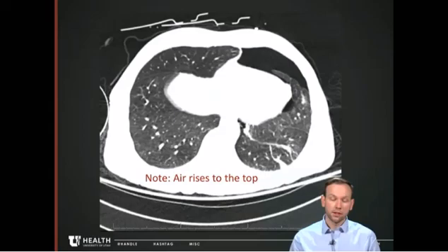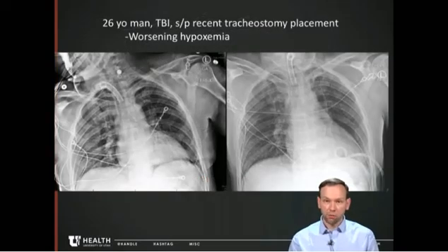side of the chest. One thing I'll also note is that the air is present just in the top of the lung, in the most anterior portion. And if you look across the screen, you can see that there is lung present all the way across the chest wall. And that's why there was no pleural line and no absence of lung markings seen on the chest x-ray.